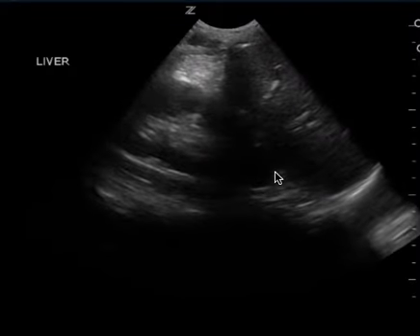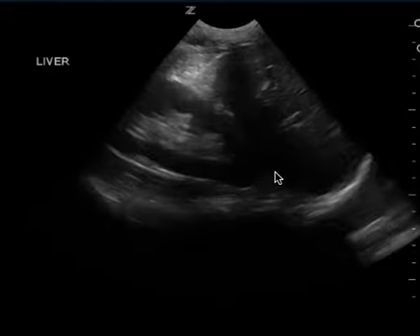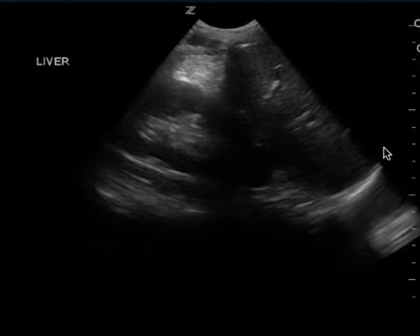The other issue too is that there's no movement with the probe. It's just focused on this one area. You need to make sure that you either move the probe or fan.